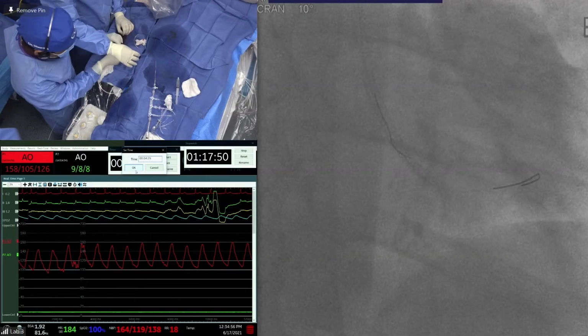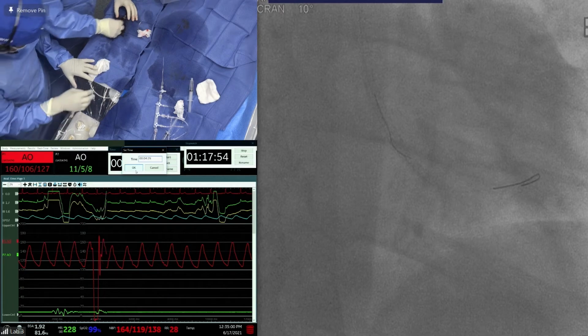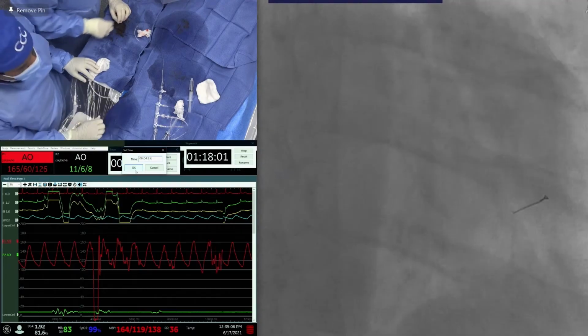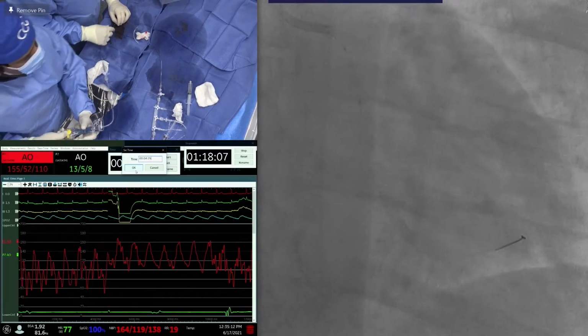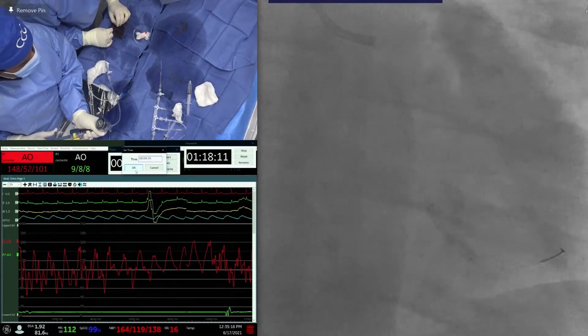So how many on this panel are using brachytherapy for these ISR cases until we get drug-coated balloons? Dr. O'Neill? Yes? And are you impressed with your results? It's too early to tell. The problem is we've done it for 30 years, and in 2 or 3 years you get late effects that you're not aware of. But at least in the first couple of years, it seems to work.